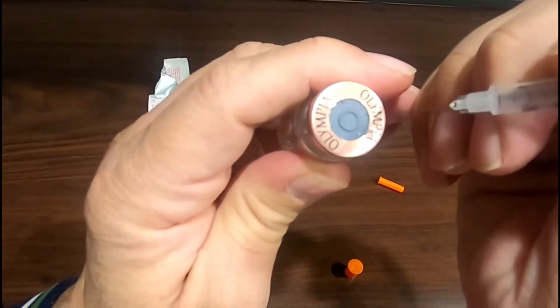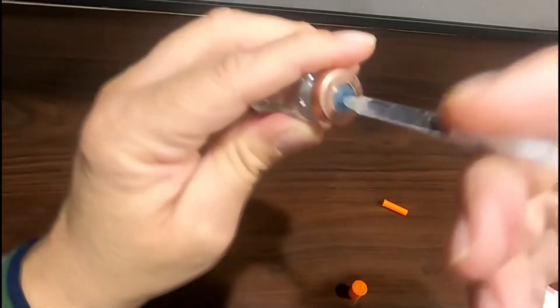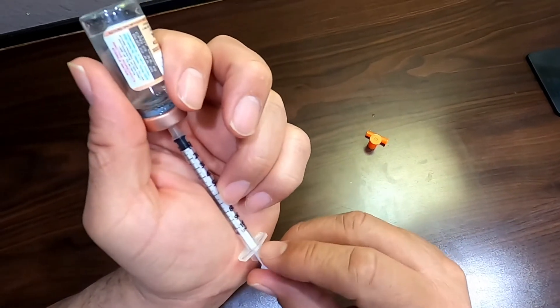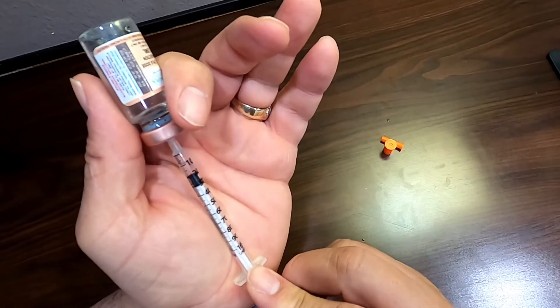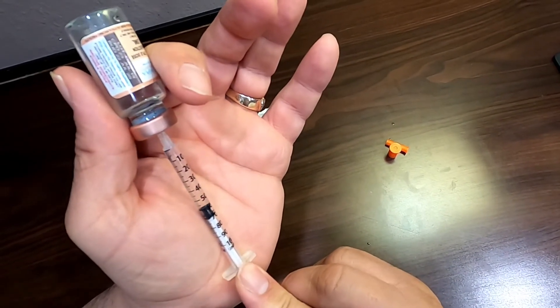Pierce the rubber stopper on top of the vial with the needle and push the air into the vial. Draw back to your prescription amount and wait for the syringe to be completely filled with the medication.